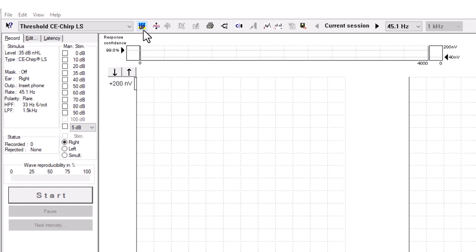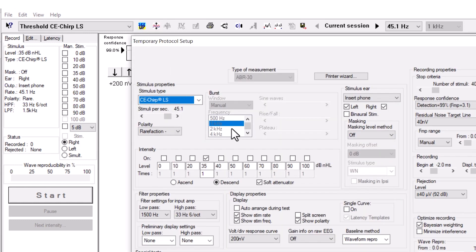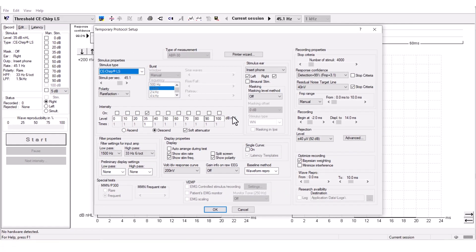This function here is the temporary protocol setup. Here you can make temporary changes to your test protocol.